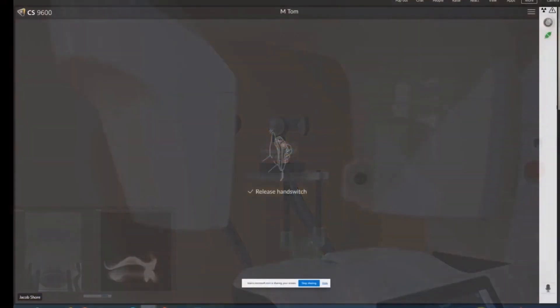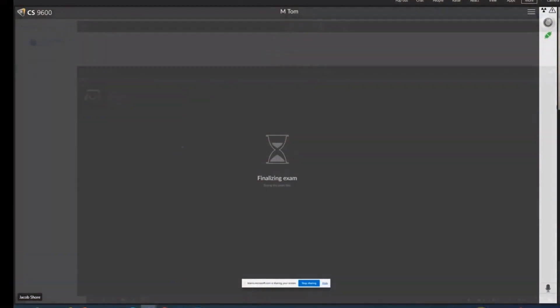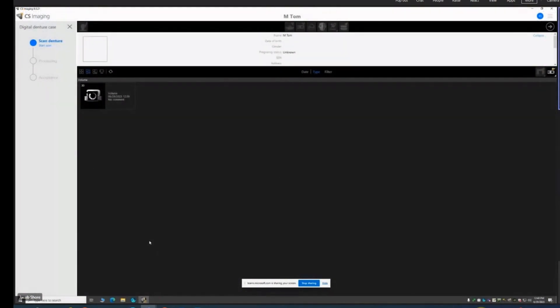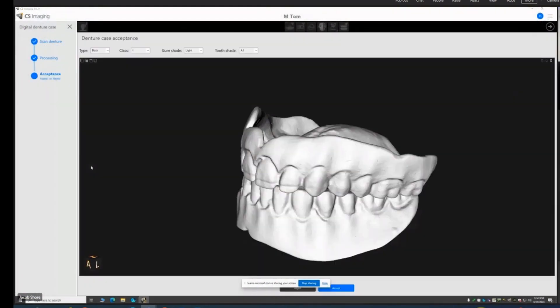After you release the hand switch, the computer takes approximately a minute to reconstruct the denture on the screen. When the reconstruction is complete, the scanned denture is displayed on the screen along with the occlusion.